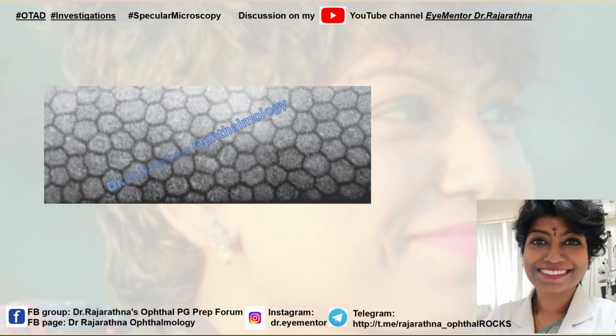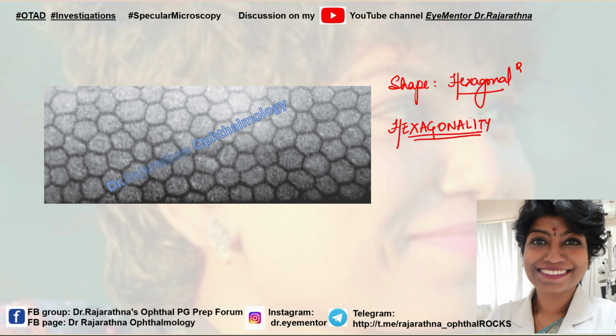Now, what is hexagonality? You all know that the shape of the endothelial cell is hexagonal. Each endothelial cell is hexagonal in shape. So we're going to see what is the percentage of cells that are hexagonal. So that is what we mean by hexagonality: the percentage of hexagonal cells. As you can see in this picture, this image is a specular microscopy picture where you can see all the cells are hexagonal. So again, you can measure hexagonality on specular microscopy.